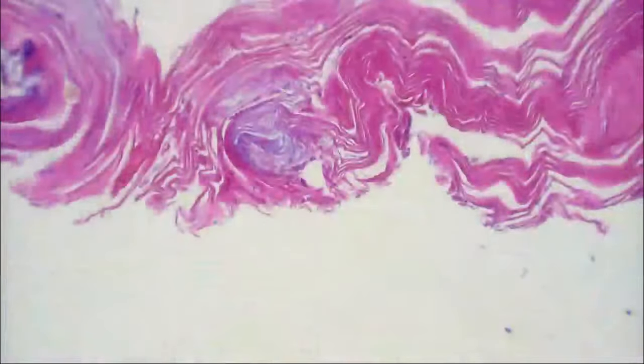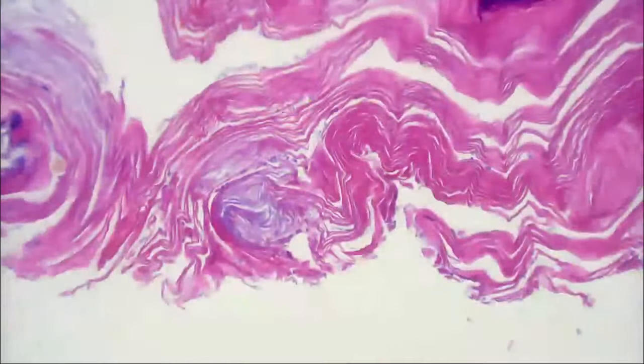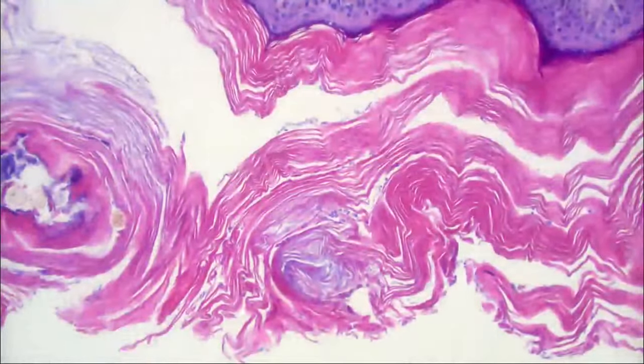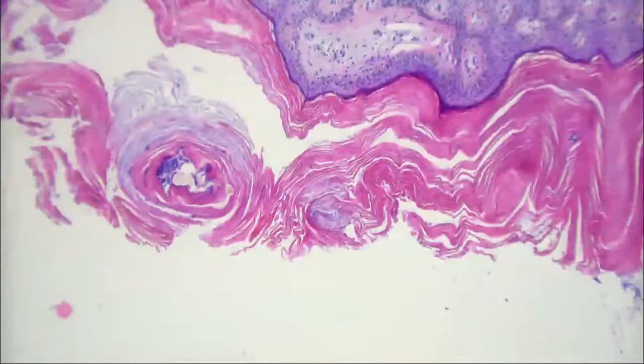Yeah. I don't see spaghetti. I just see meatballs only. Yeah, maybe I saw the meatballs. I was trying to imagine that there might be spaghetti too, but there is pityrosporum. There's a lot of that, and some people think that actually plays a role in the cause of this process. So, what was your differential? The differential that I wrote was tinea versus candidiasis, but maybe I can elaborate and change that a little bit now.